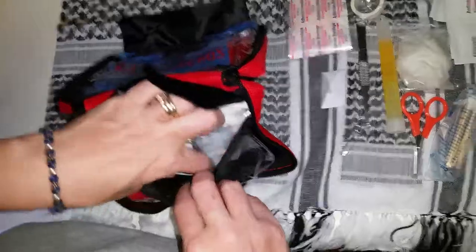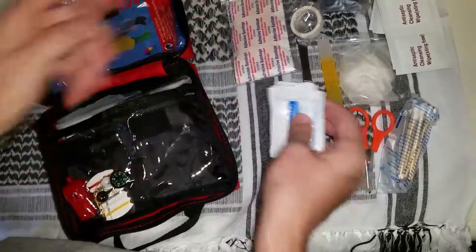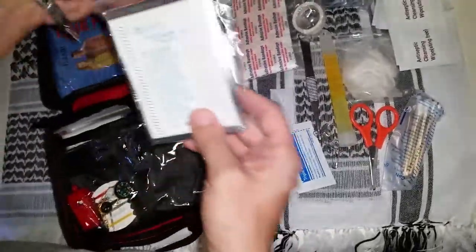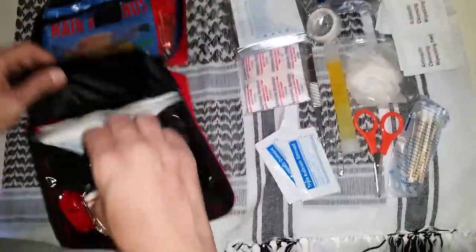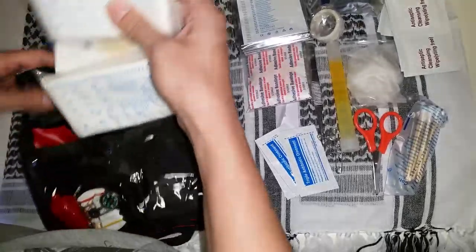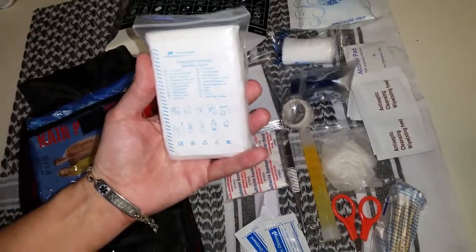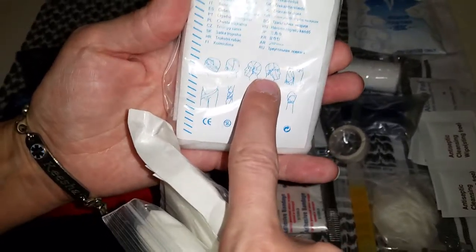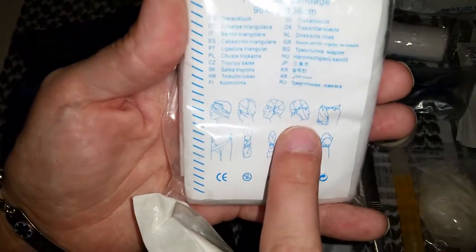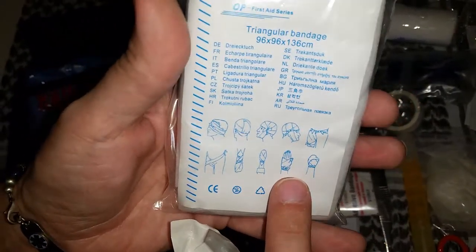And then the bigger pouch. Triple antibiotic. A first aid blanket. Triangular bandage — you can use those for lots of things. You can use them if you sprain an arm and need to make a sling. It actually shows on here, if you dislocate a jaw you can wrap that around and stabilize it. So you can really secure a lot of things until you get to professional medical treatment.